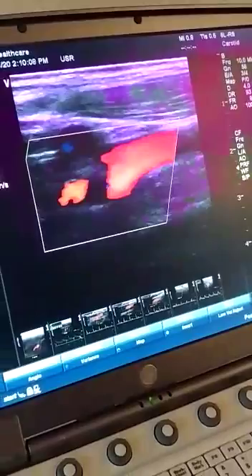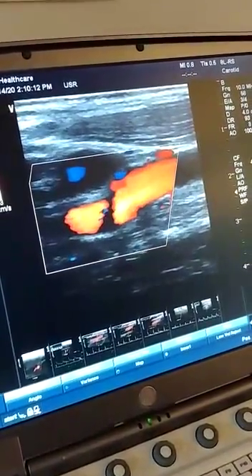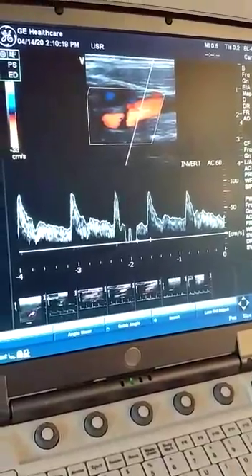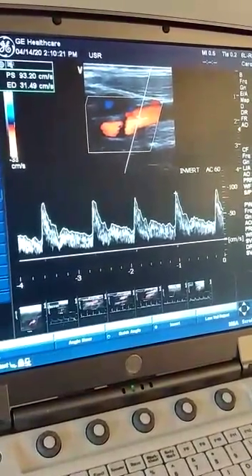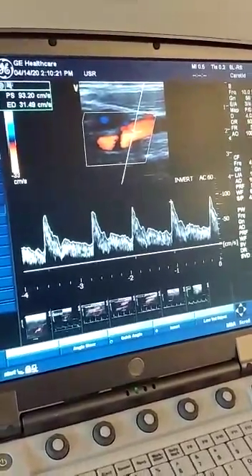You want to get your vertebral artery right after you're done with your distal CCA. Now I'm going to follow towards the head — I'm actually going to come out of Doppler here for a second and increase my color box just a little bit. Actually, we're going to go ahead and obtain a bulb. The bulb is right where your CCA splits into the ICA and the ECA, so that's my bulb. I'm going to go ahead and store that image.